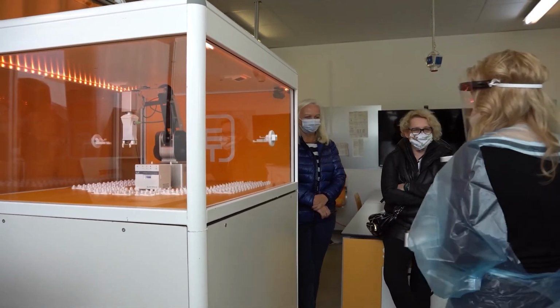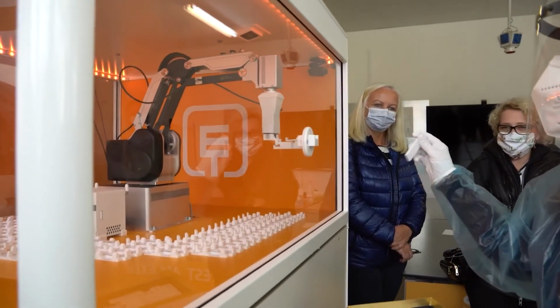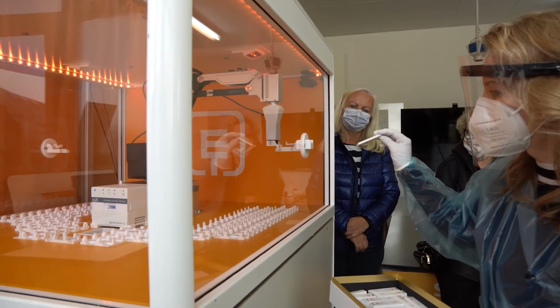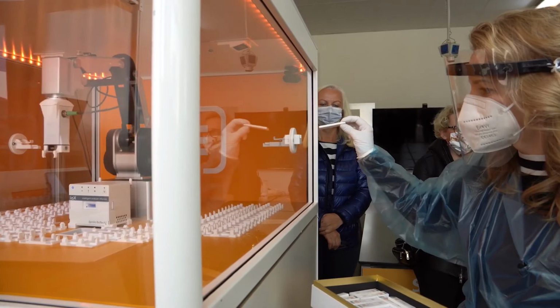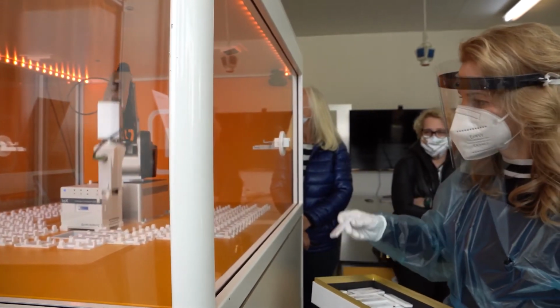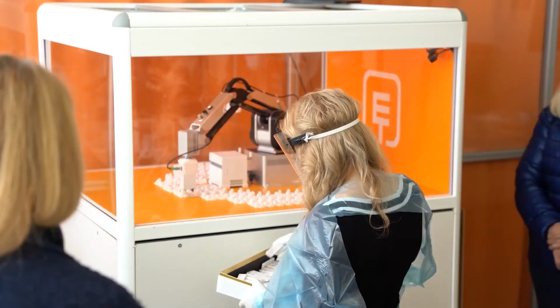It's prepared. But now we have to wait 15 minutes. Okay, but it's not a problem because we don't have customers until late. So we can organize 80 tests for 15 minutes. Maybe it's interesting when you have a crowd of people that want to be tested in a hospital or something like that, or a concert hall.